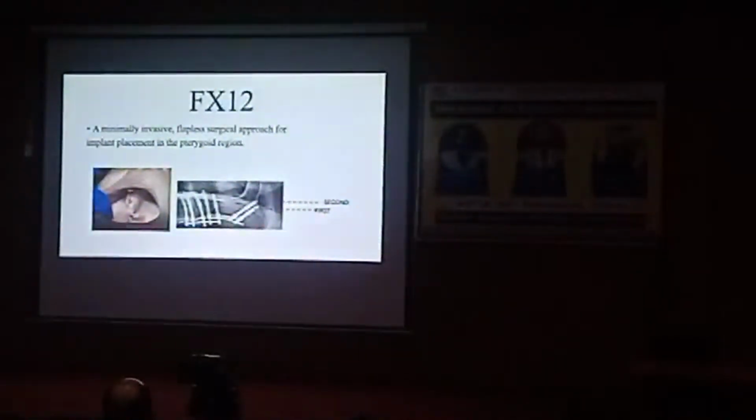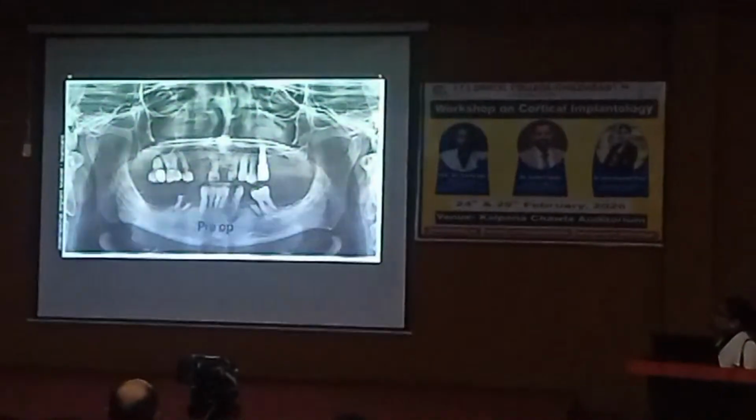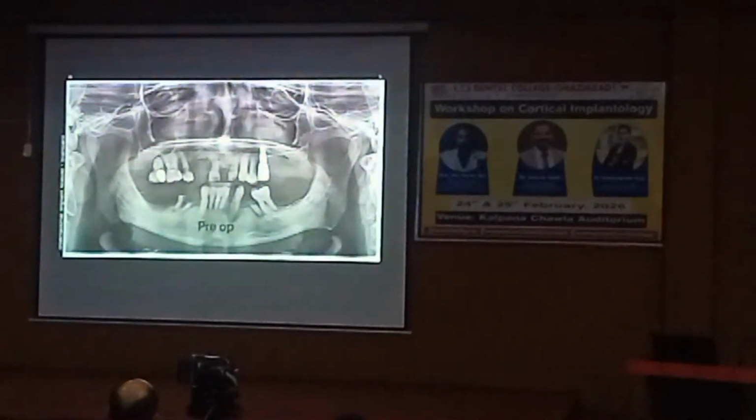So FX12, a minimally invasive surgical approach for implant placement in the pterygoid region. You can see no bleeding. We have seen the video of it. There is no bleeding, no pain, no flap, no nothing. And we successfully placed 2 pterygoid implants. And now let's discuss all the cases. I think not discuss, we'll see the outcomes.